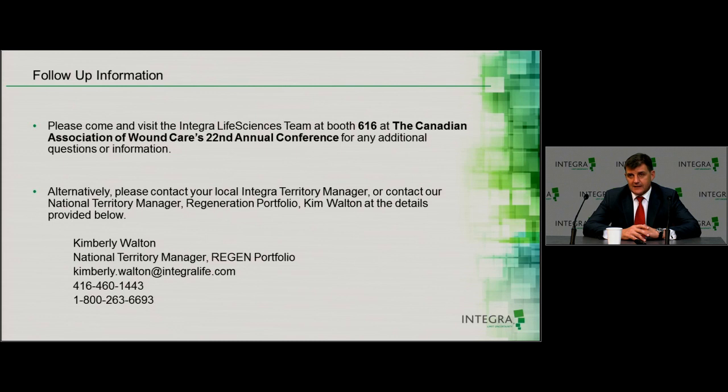In the inpatient setting, we change the negative pressure wound therapy over it after 4 days and then move to a secondary dressing. The first 2 weeks, we do weekly dressing changes, and after that, we'll allow people to do more frequent dressing changes, possibly 3 times a week. But we're actually okay with leaving it on weekly for up to almost the 1 month period.